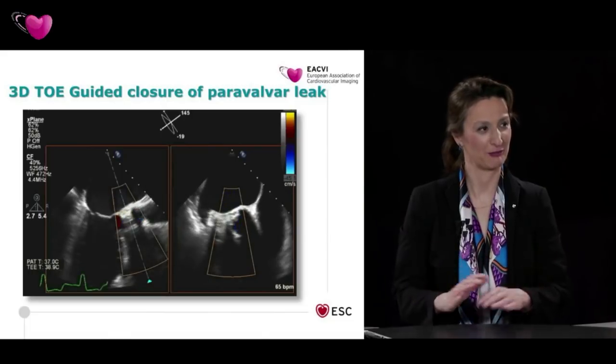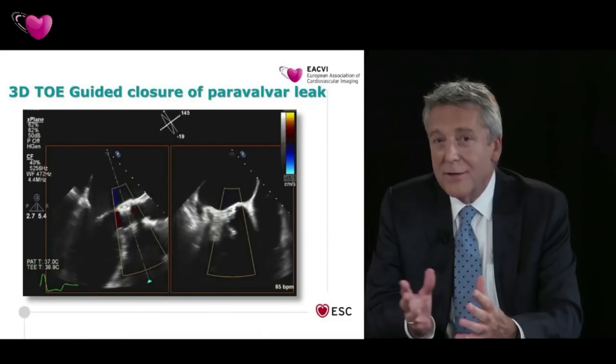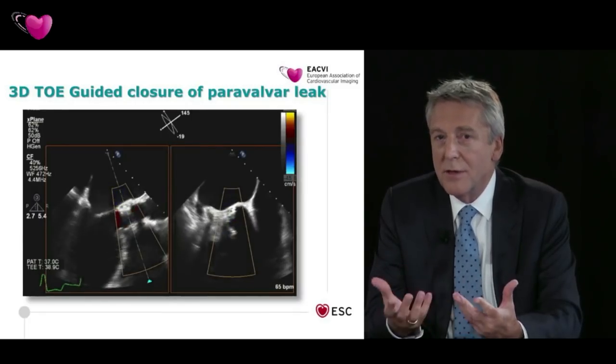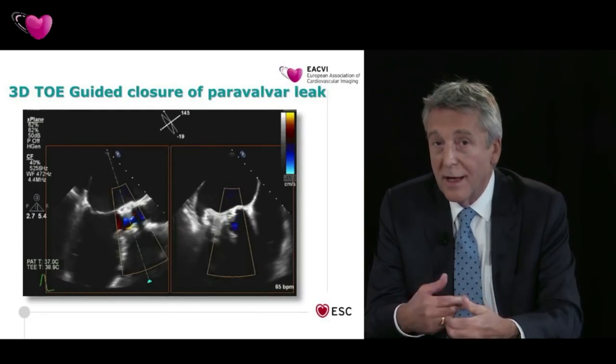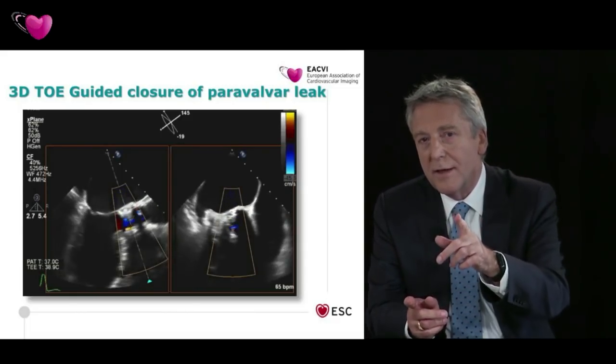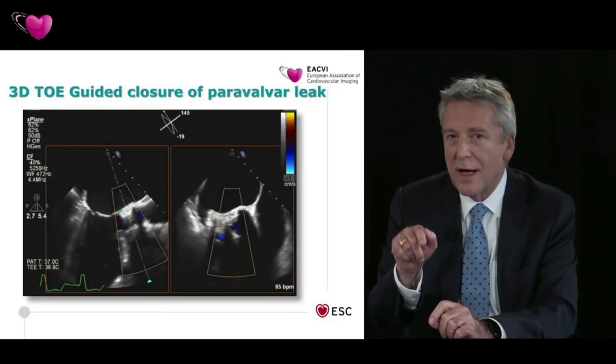It's not that common practice, right? It's not. It is a little bit more complicated, but actually, with some of the modern imaging modalities that we have available to us, like fusion imaging, because the difficulty with something like this is actually getting across the aortic valve in the right position.